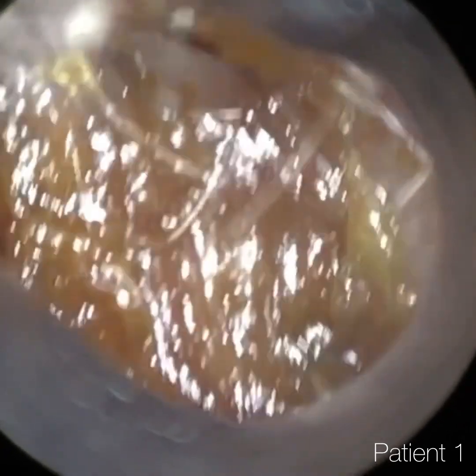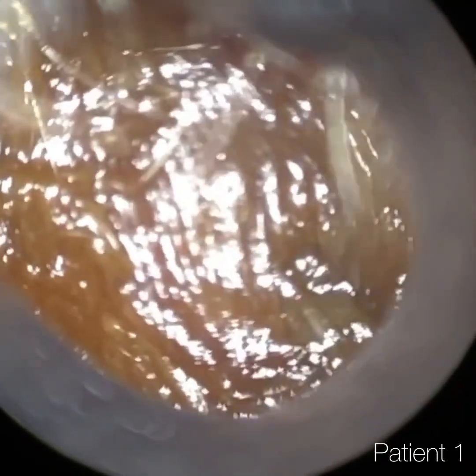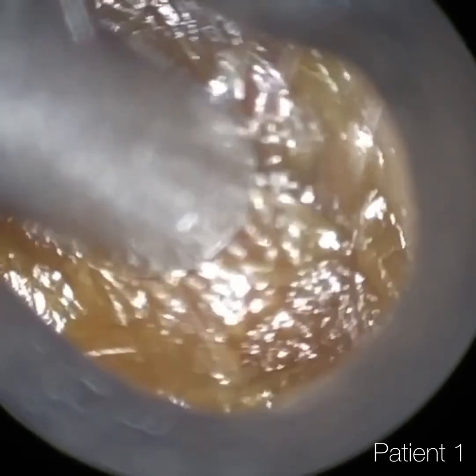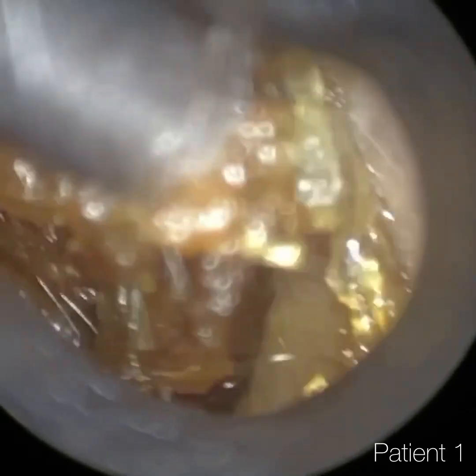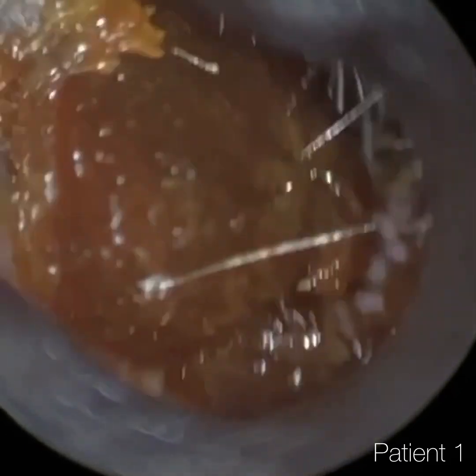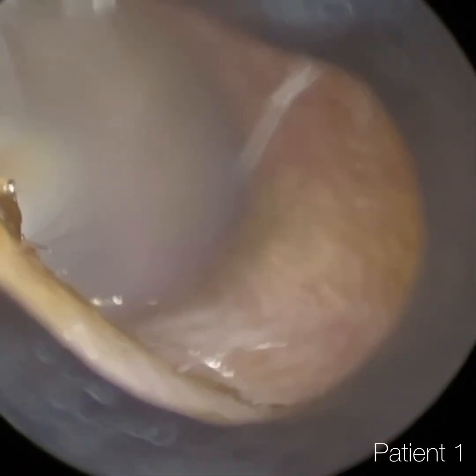Thank you for joining me in what is another demonstration video of our recently developed Waxscope. The Waxscope isn't yet commercially available — we're anticipating early autumn, so in the next few months. If you are interested in the Waxscope, please do register your interest by emailing info at clearwax.co.uk and we shall add you to our mailing list.